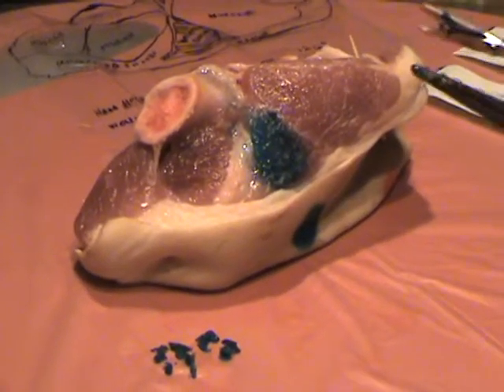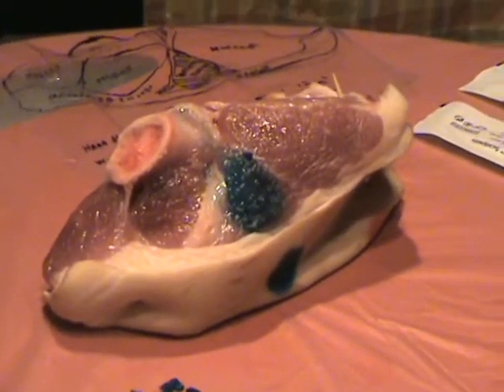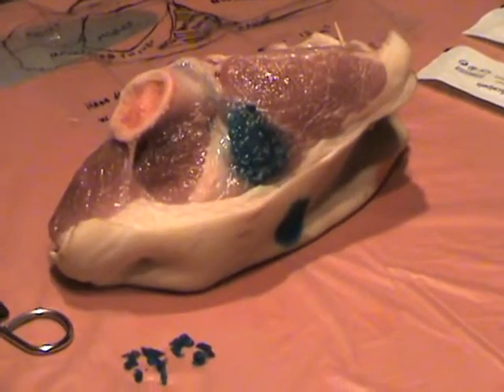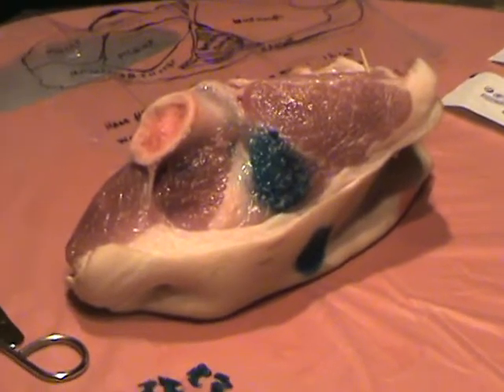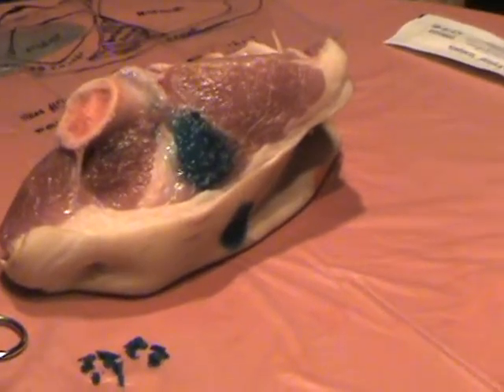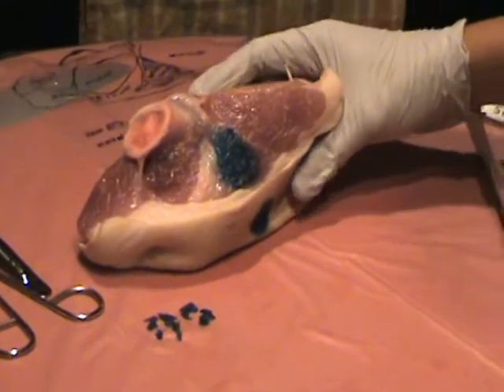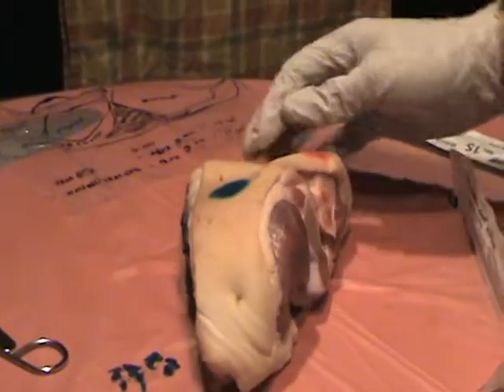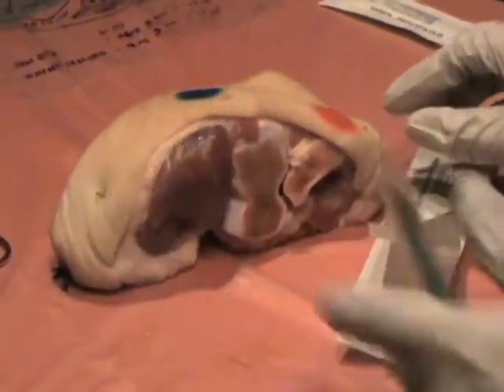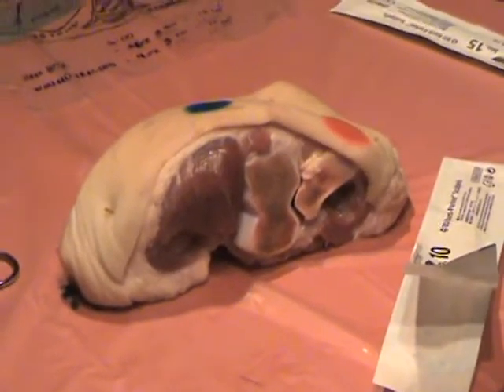Now we're gonna move to the second exercise, which is shaving the calluses. So let me just rest it over there. Okay, so we'll be using the number 10 scalpel. Number 10, and I'm gonna flip the meat like that, and I put the red dye over here on the bony prominences, where you can see the callus most of the time.